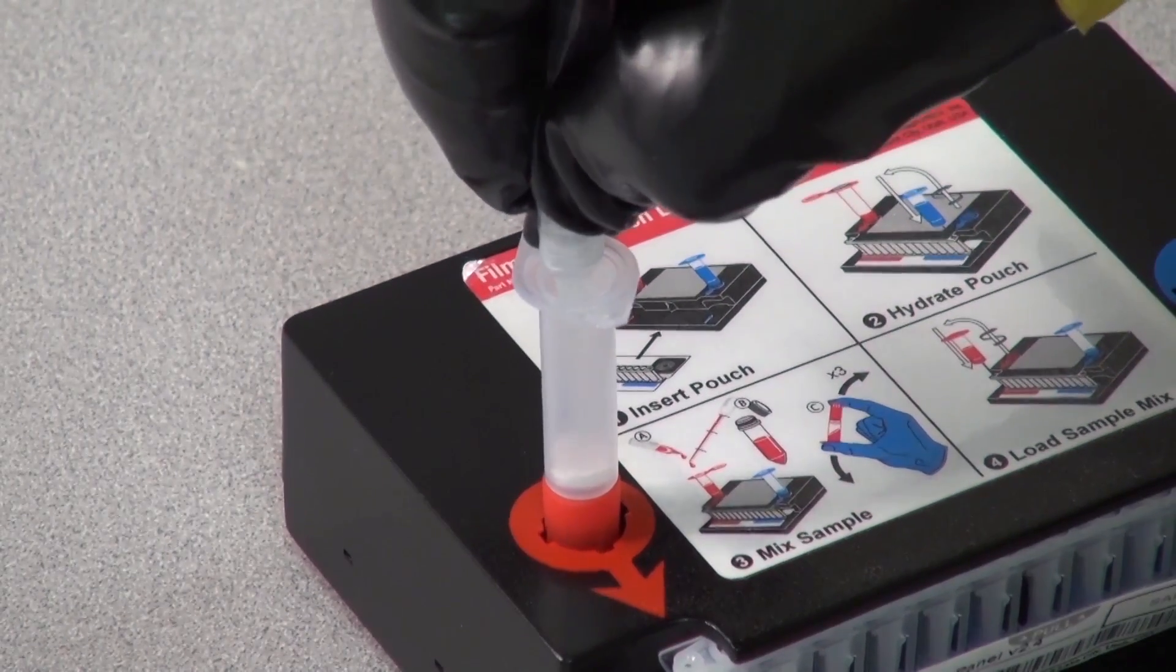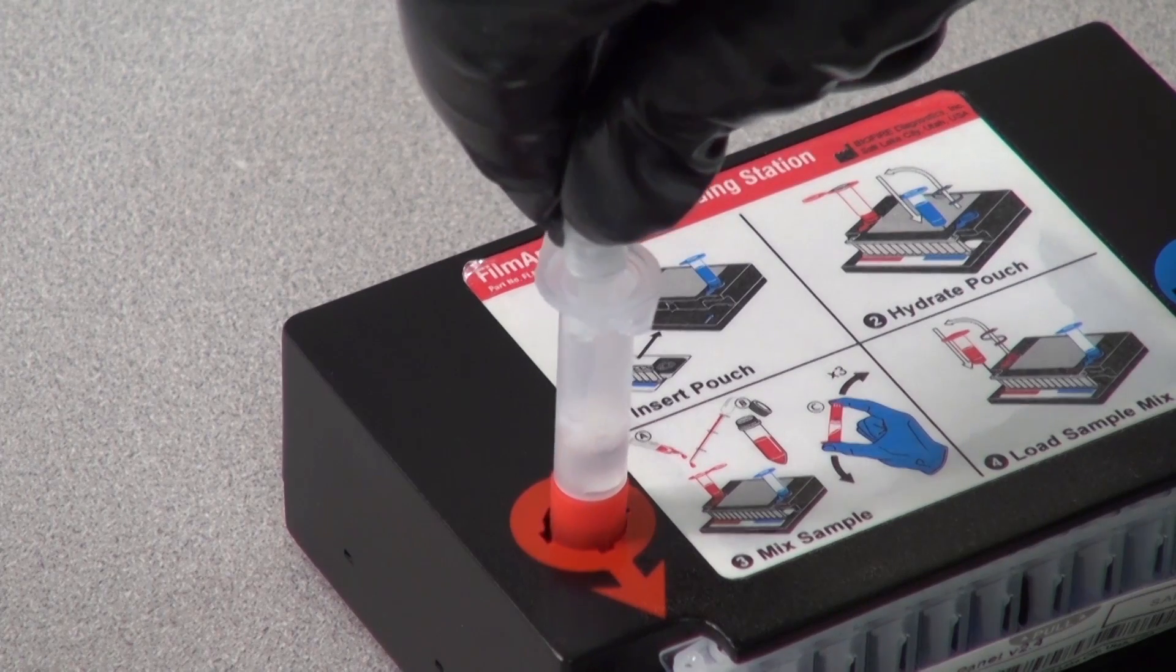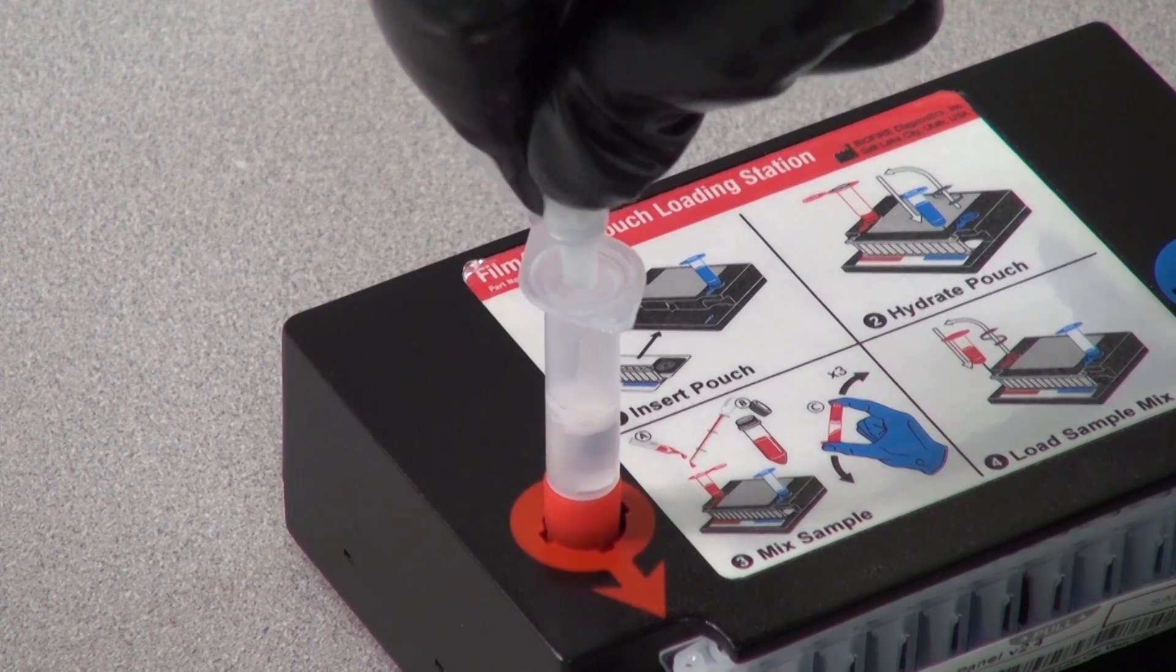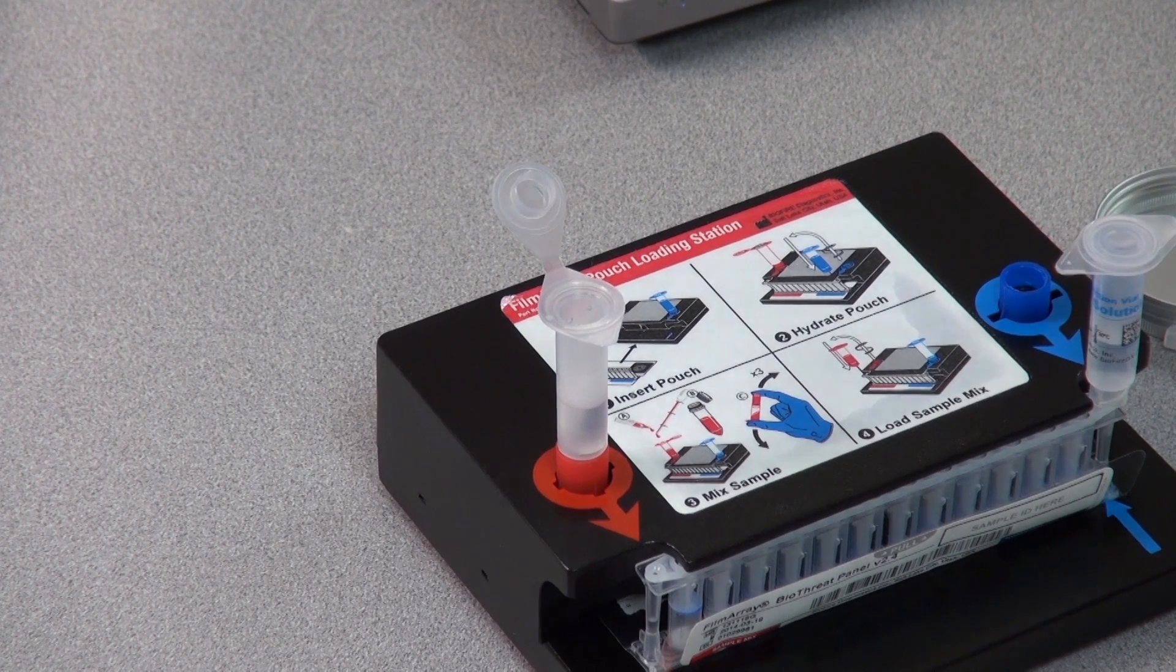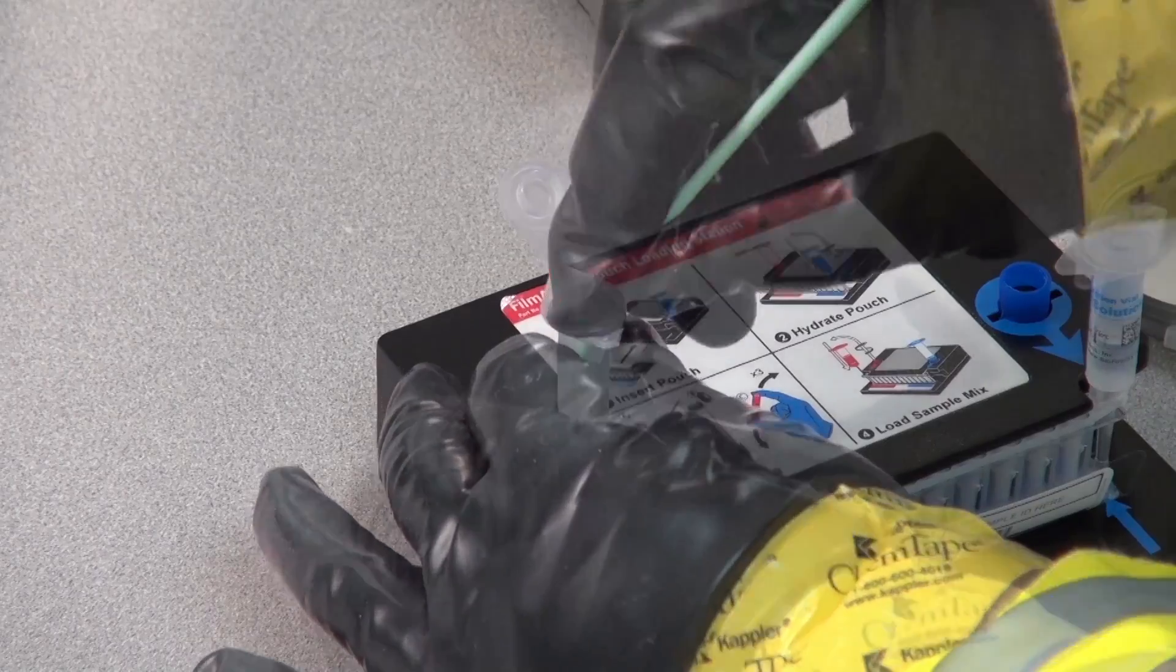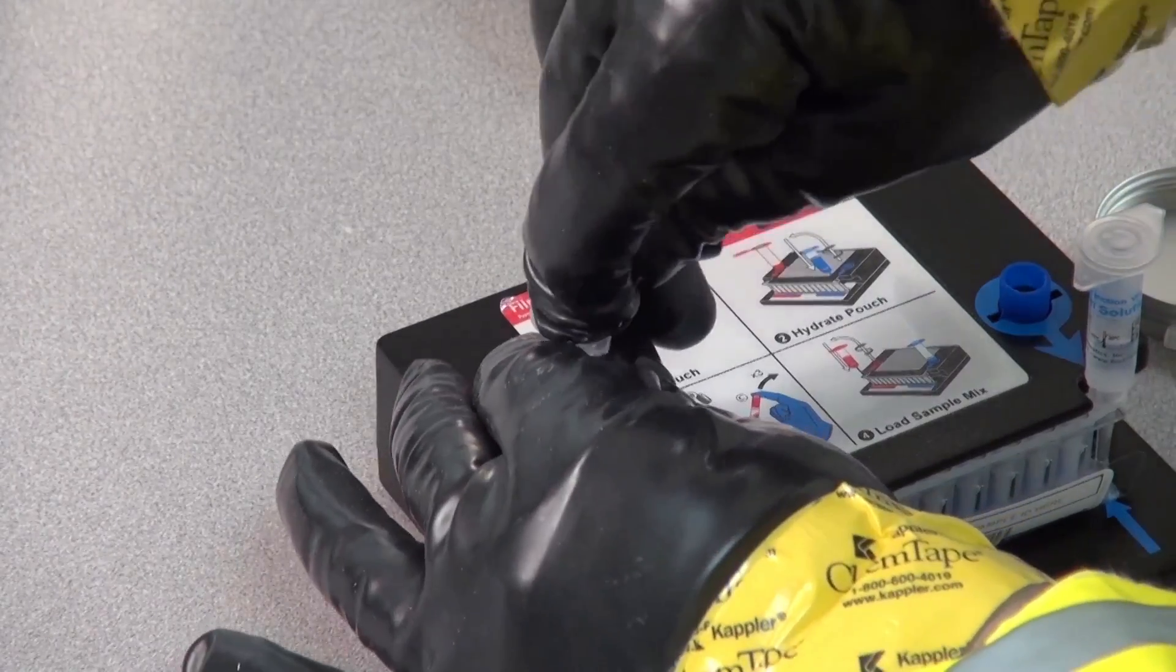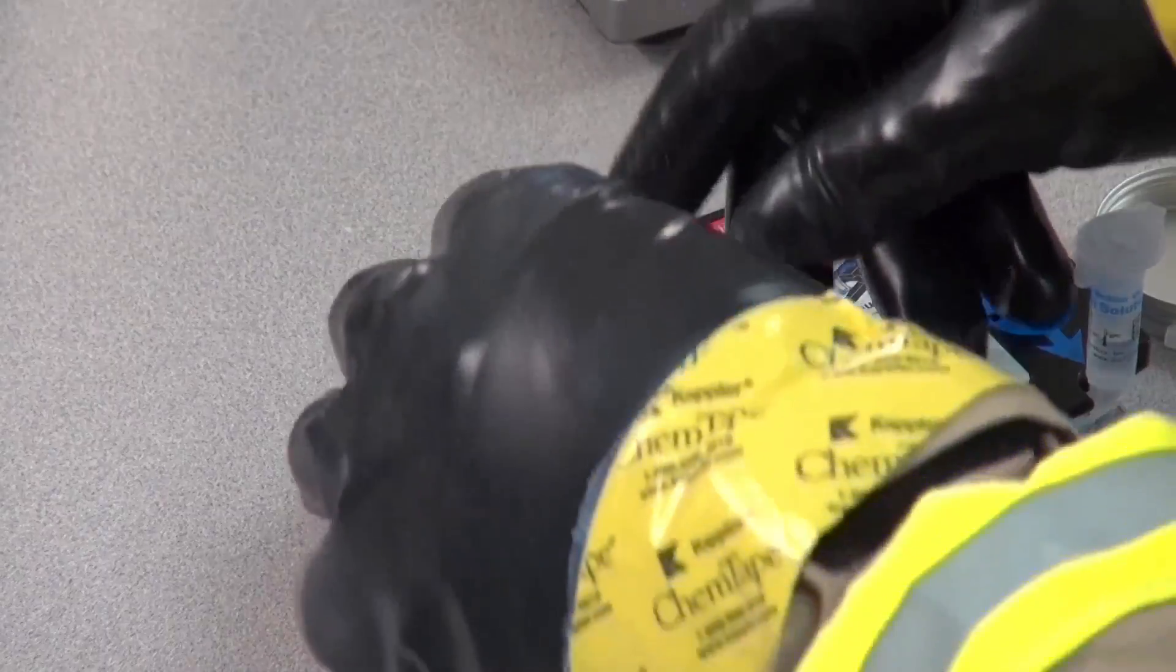Next, collect a sample. Squeeze the buffer into the red injection vial on the loading station. Avoid making bubbles. Use a swab to collect a sample, but don't overload it. Drop the swab in the red vial. Cap and remove the red vial, inverting it three times before returning it to the loading station.